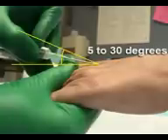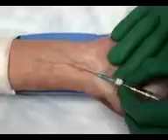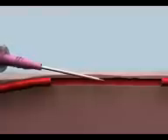With your dominant hand, insert the metal needle bevel up at a 5 to 30-degree angle through the skin and into the vein. The angle used to approach the vein is dependent on the depth of the vein. A lesser angle is required for superficial veins. Do not insert the catheter too deeply, as this risks penetrating the far wall of the vein. When the catheter enters the vein lumen, watch for the initial flashback of blood, which will slowly fill the catheter chamber. Once the metal needle and plastic cannula are in the lumen, lower the catheter so that it is almost parallel to the skin.